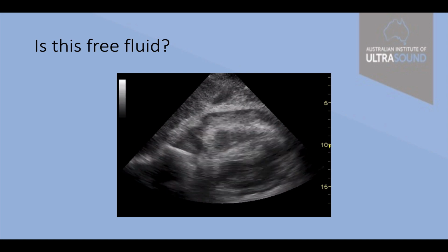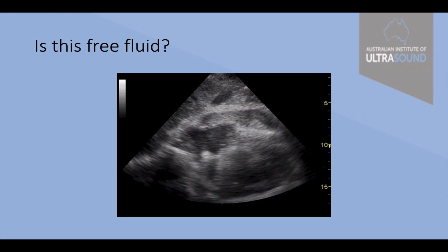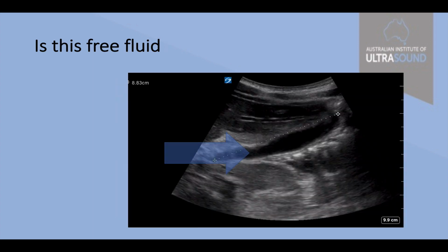So when you do have free fluid, take the time to look through it and see how things are behaving on the other side. I'm just throwing you all these pictures randomly because I want you to calibrate your brain. What do you think about this strip of fluid? That's just underneath the lower pole of the liver. I told you that's an important place to look.